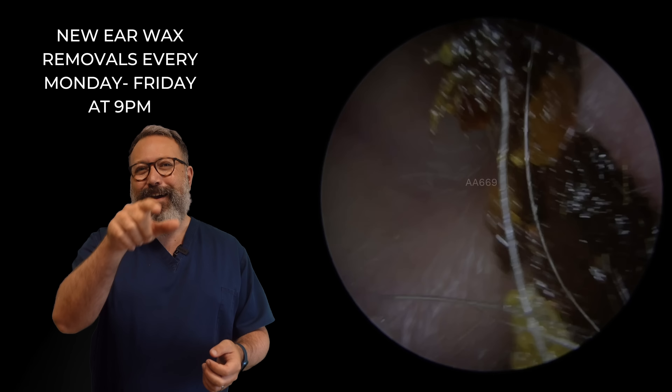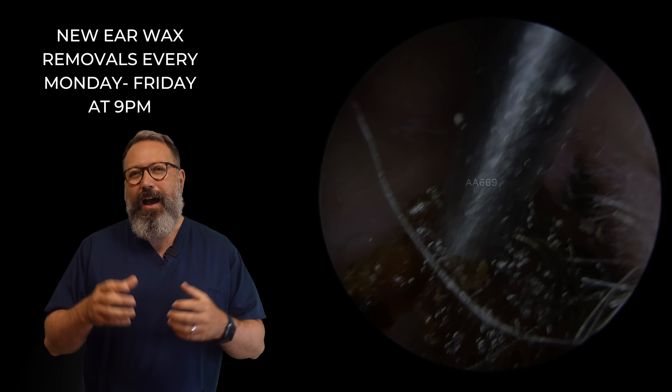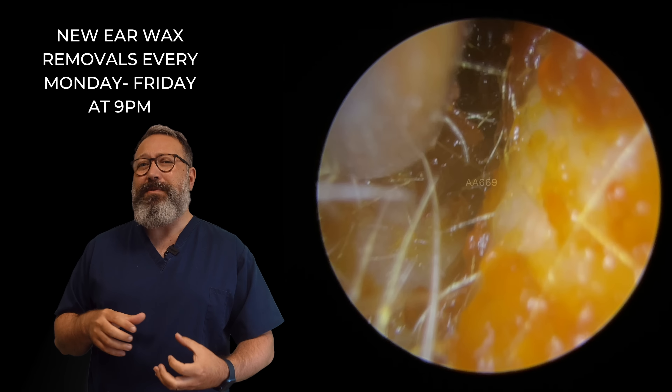That was actually this gent. You can see he's come through now. This is 12 months later actually from that video, I think. And you can see we've got these really, really thick, hard pieces that are just adhering to the canal wall. You do tend to find they get a little bit longer in this particular patient as well.